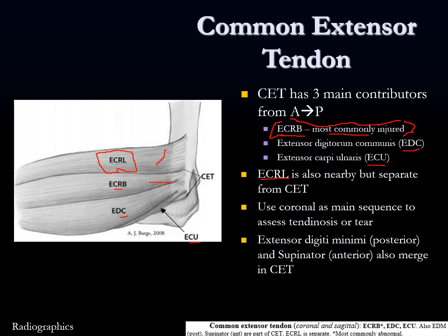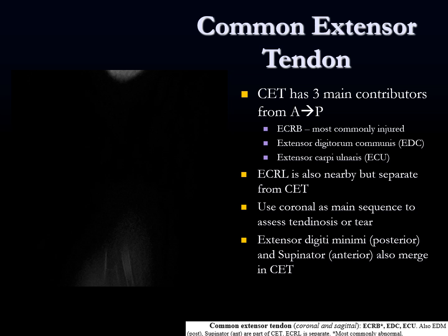A couple of other tendons also merge into the common extensor tendon origin: the posterior part has extensor digiti minimi and the anterior part has supinator. There's a lot of anatomy to get down, but if you read these on a routine basis it's good to know what's on the margins of the common extensor tendon insertion, or you just look it up. Let's look at these on the scrollable images to see if it makes more sense.